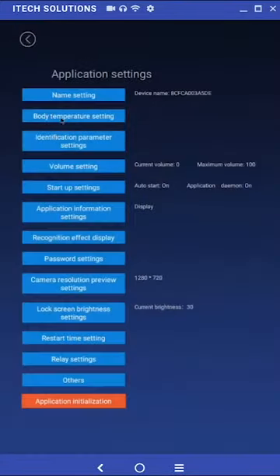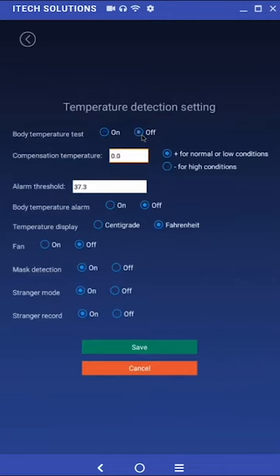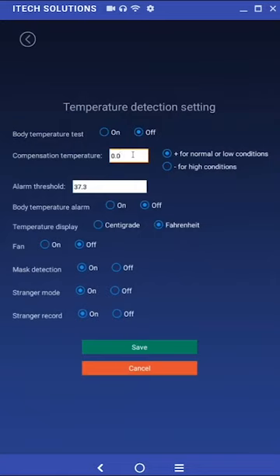Body temperature settings. There are several options here that you can change. The first setting is body temperature test. Turning this off will disable the temperature reading upon checking in. The compensation temperature is an offset that can be applied to the temperature reading to adjust for surrounding conditions. You can select plus or minus to adjust as needed. We recommend using another thermometer to accurately adjust the compensation setting.